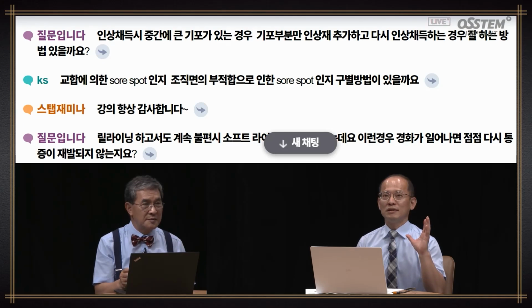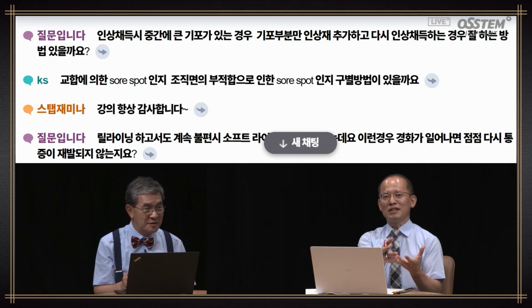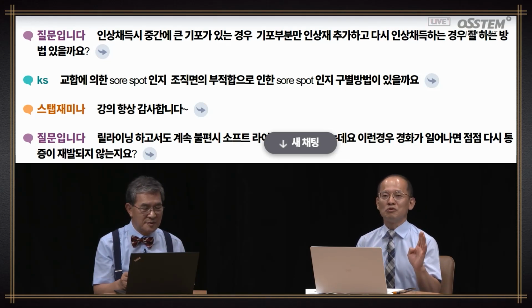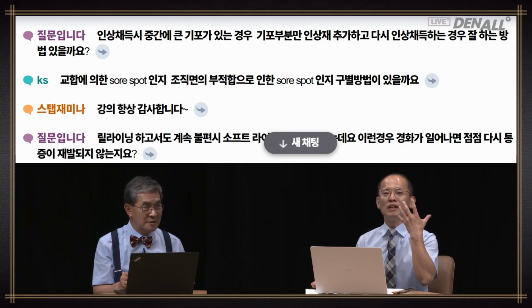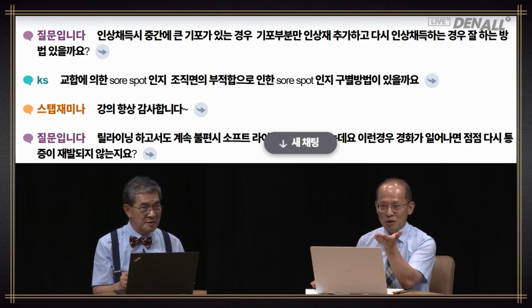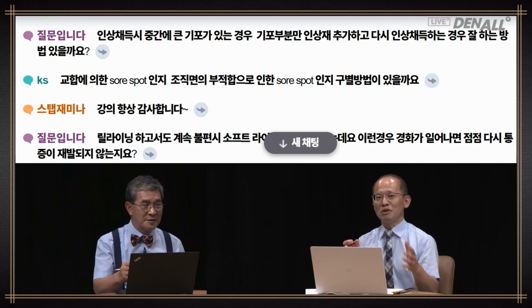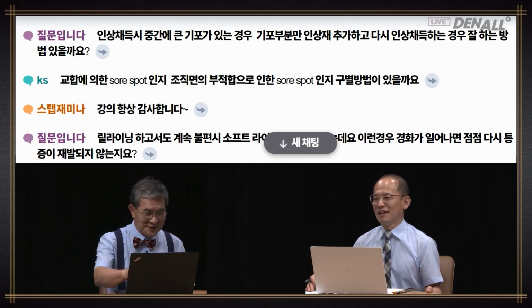I think the first mistake is you use too much of the material. So you have to use less in volume. So you move it to the border molding, the relief, that's only what you need. So you have to use a small amount, then you can have a clean result on your hand. But still, if you have a big bubble, then, as you said, you add impression material only in the bubble and reposition it. That's it. So you already know how to tackle that situation.